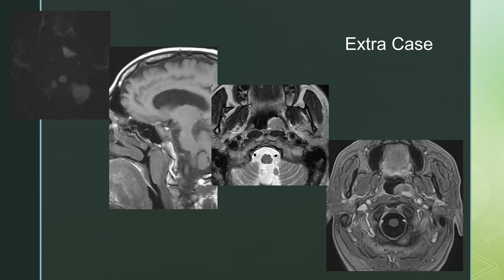An extra case: this lesion was seen incidentally on a brain MRI. There is a polypoid mass in the nasopharynx that is isointense on T1. On T2, it's slightly hypointense but not super dark. There's minimal enhancement — maybe a little peripheral — but it does show restricted diffusion on DWI. This is actually a nasopharyngeal lymphoma.